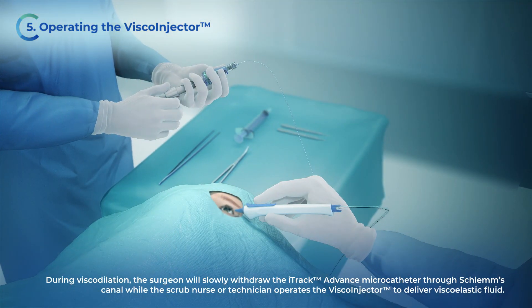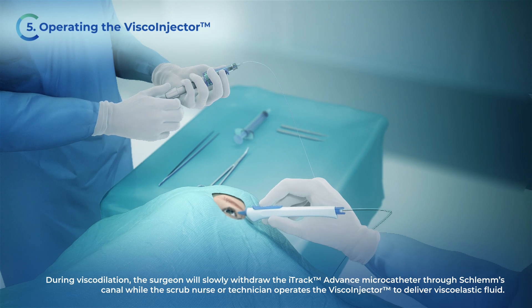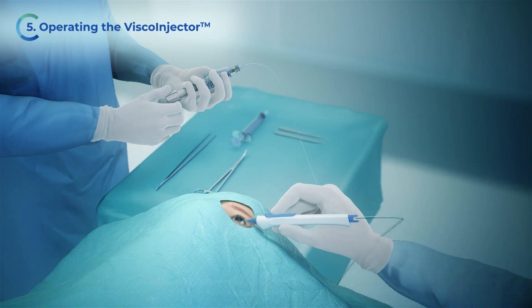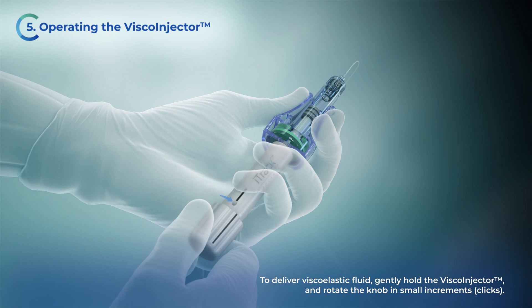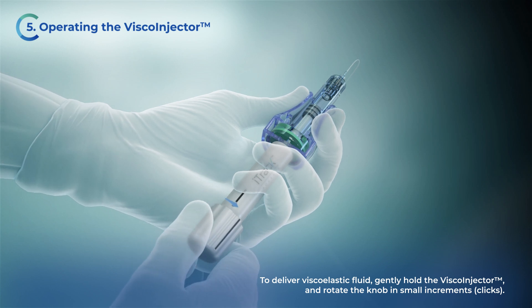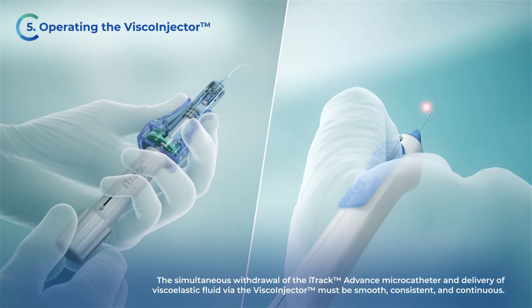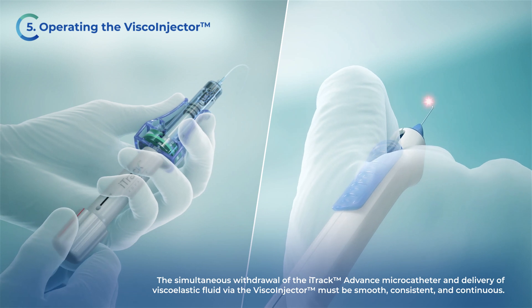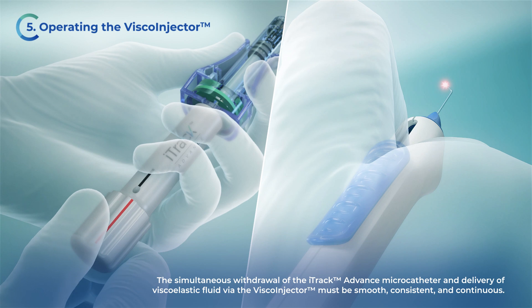During viscodilation, the surgeon will slowly withdraw the iTruck Advance microcatheter through Schlem's canal, while the scrub nurse or technician operates the VSCO injector to deliver viscoelastic fluid. To deliver viscoelastic fluid, gently hold the VSCO injector and rotate the knob in small increments or clicks. The simultaneous withdrawal of the iTruck Advance microcatheter and delivery of viscoelastic fluid via the VSCO injector must be smooth, consistent, and continuous.